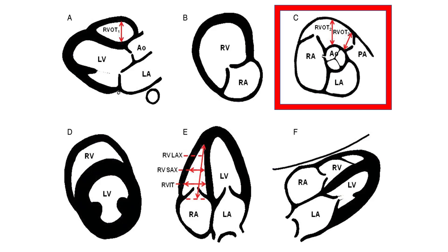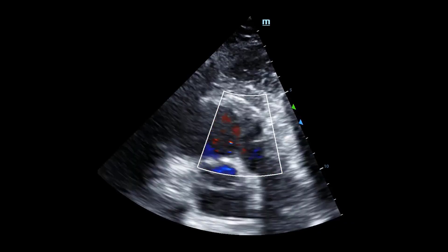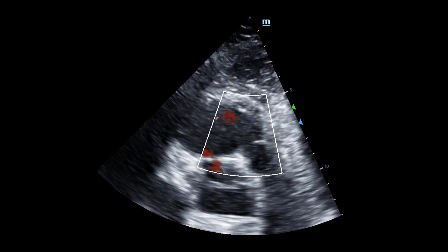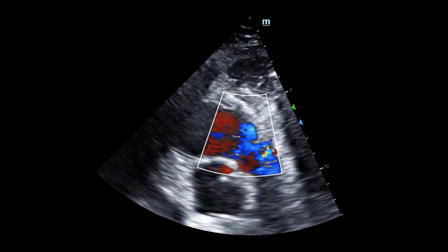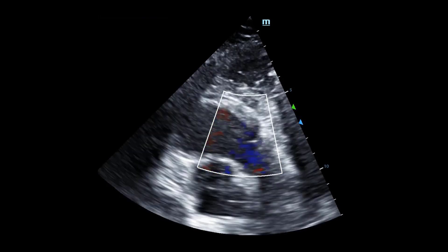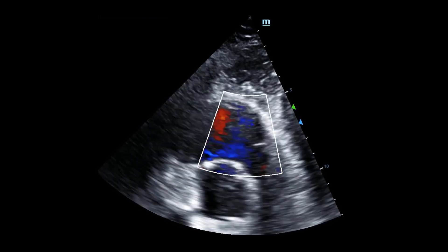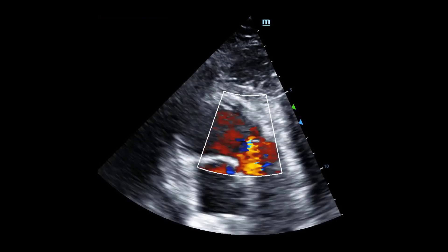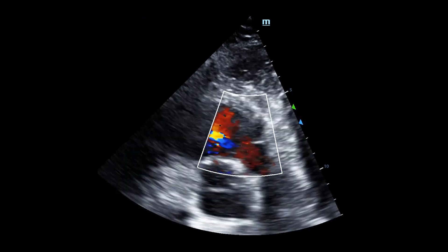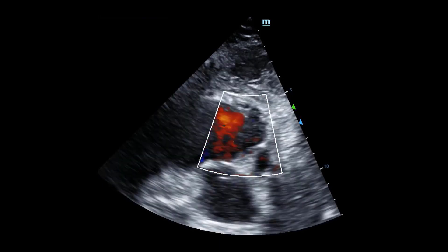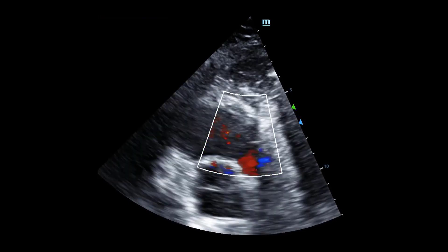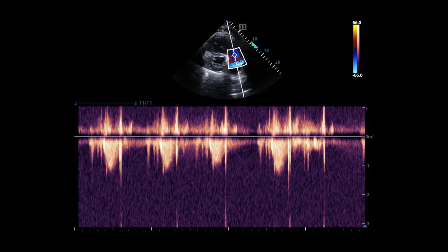Another view to assess the RV is either the parasternal short axis or subcostal short axis, viewing the aortic valve and right ventricular outflow tract. At the bottom we have the aortic valve, and at the top — closest to the probe — we can see the pulmonary artery and pulmonic valve with color Doppler across it. Pulse wave Doppler can be placed here to look at pulmonary valve acceleration time and potentially calculate the mean pulmonary artery pressure. Color Doppler across the valve can also be used to determine whether there is any significant pulmonary regurgitation.